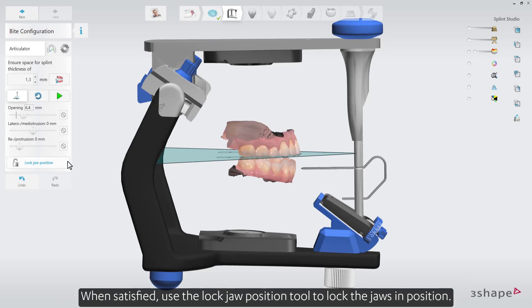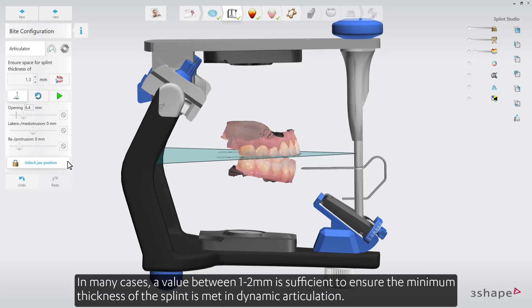When satisfied, use the Lock Jaw Position tool to lock the jaws in position. In many cases, a value between 1 to 2 millimeters is sufficient to ensure the minimum thickness of the splint is met in dynamic articulation.